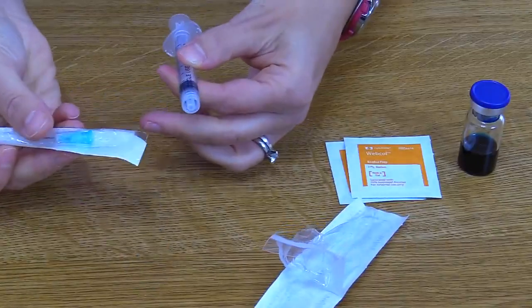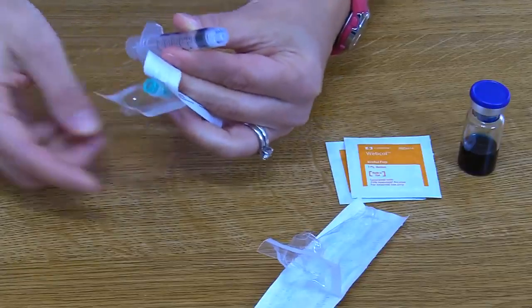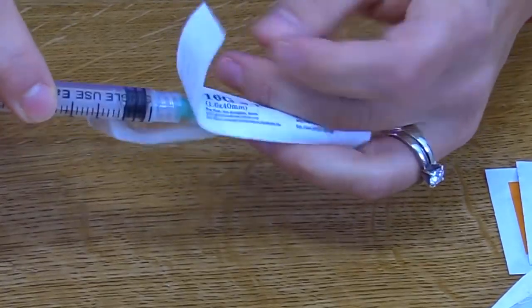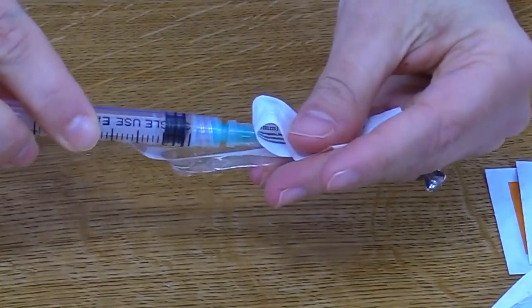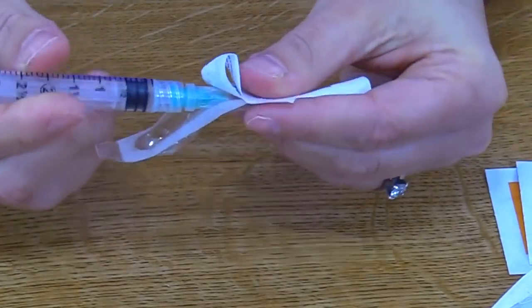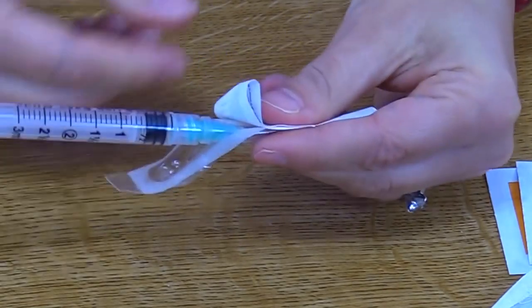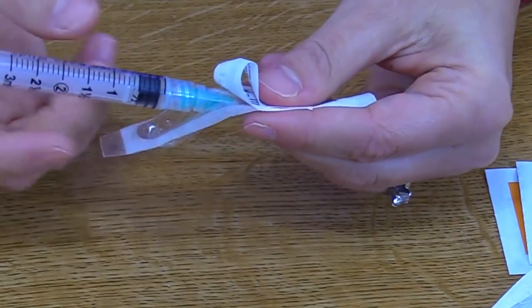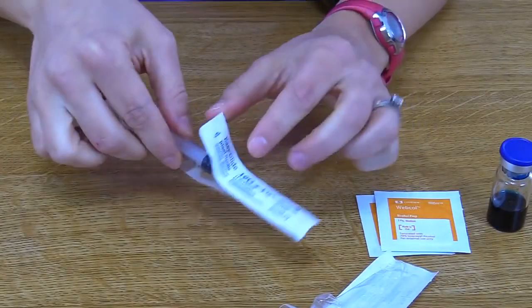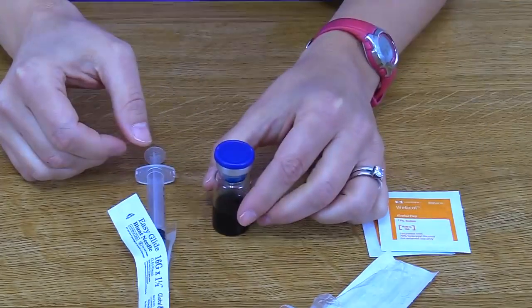Then we're going to attach this on here. So we're just going to open this up, and we're going to put our adapter into the end of the needle. And this is very important: you want to twist it and make sure it's on there very securely, because if not, while you're withdrawing the medication or going to administer it, it can easily become loose, and then you're going to have to start all over. After you have done that, you want to keep it in its packaging with its cap on and just set it aside while you start to prep your vial.